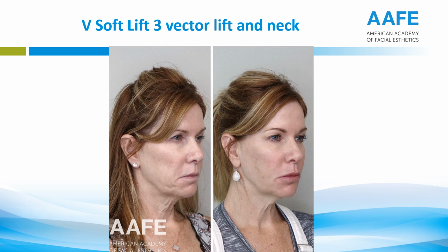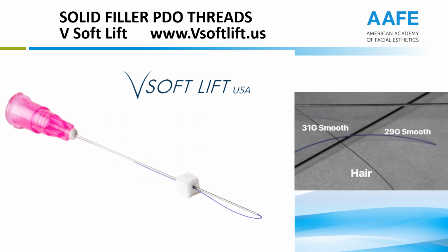So let's go ahead and show you these V-Soft Lift PDO threads, the smooth PDO threads. Now, what's different about these than all of the others? What's really different about these is they have a special polymer coating that is going to be much different than anything else, in terms of they slowly break down.